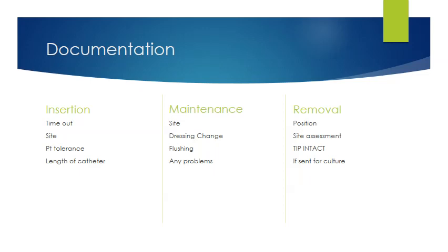During maintenance of it, again, you're always assessing your site. Your dressing changes have to be documented, flushing. If there's any problems with it while it's going in, you have to document that. And then removal, positioning, site assessment, always ever important that that tip is intact. And then a lot of times with central lines, especially if we're concerned that there's an infection, then we would send it for culture, and you would obviously document that you did that. And I believe that is the end of your lecture on central lines.